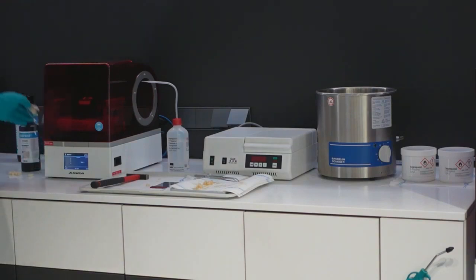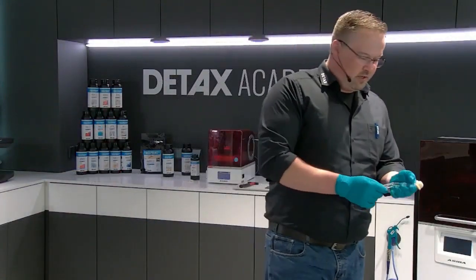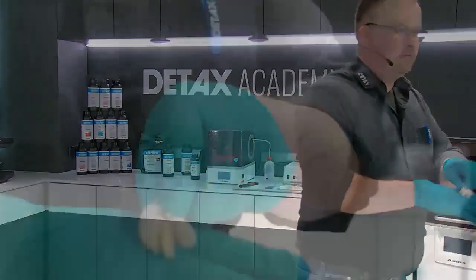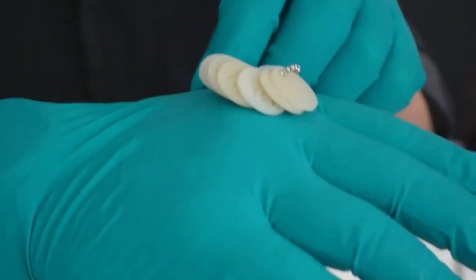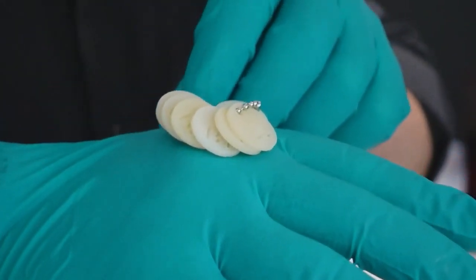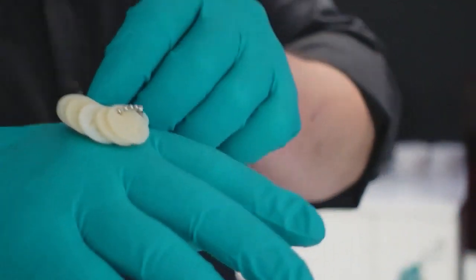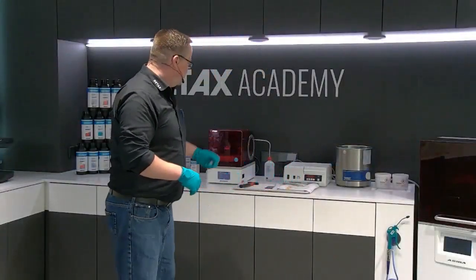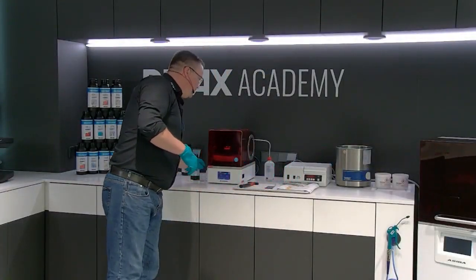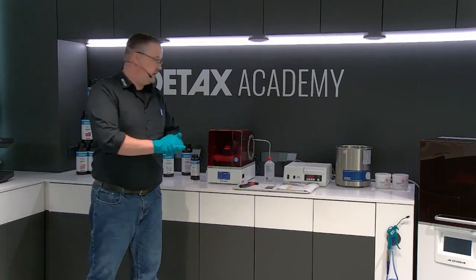It's also possible to use. And one more question was the color. We have a lot of different colors. It is not so easy to see by the camera, also with the color of my gloves. But we have some A, some B colors, C and D colors, A1, A2, A3. You can find it also in our catalog. If you need more information, please let us know. We can give you all the information that's needed.